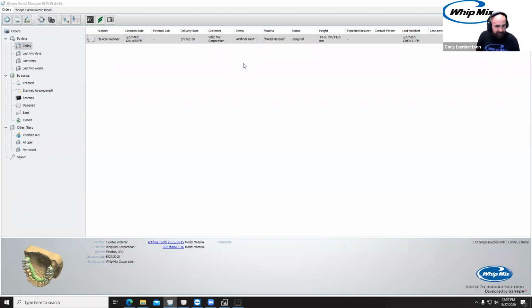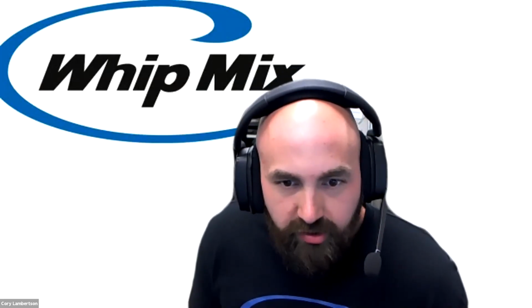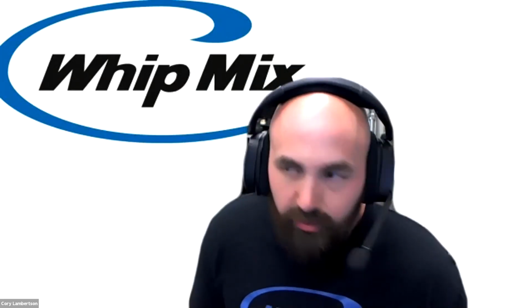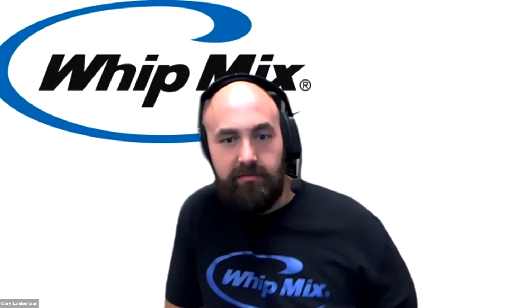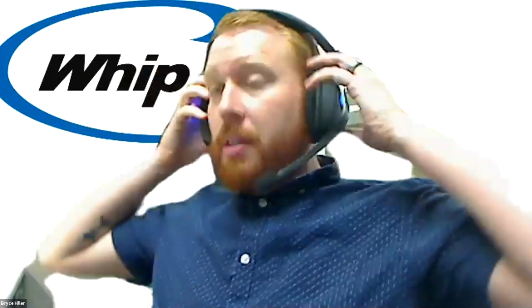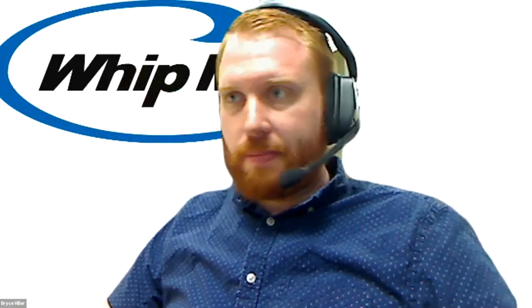And then another question came through that says, what material do you use to bond the teeth in a flexible base framework? That's a really good question. It depends on what materials you're using. There are various bonders. It depends on the teeth and on the framework material. There's a ton of companies out there that make bonders for various acrylics, plastics, and resins.